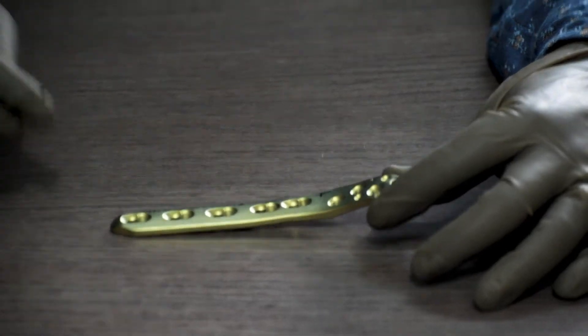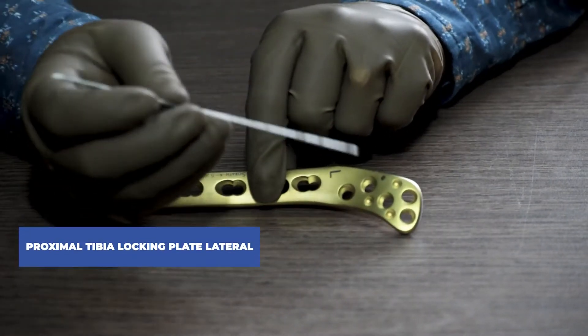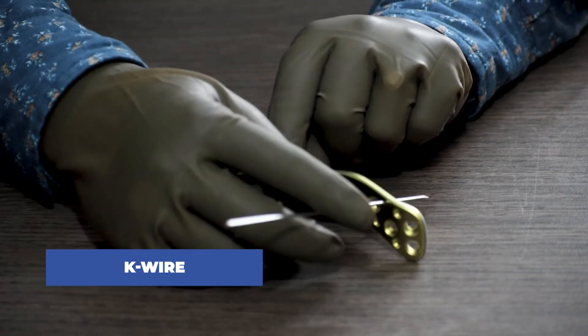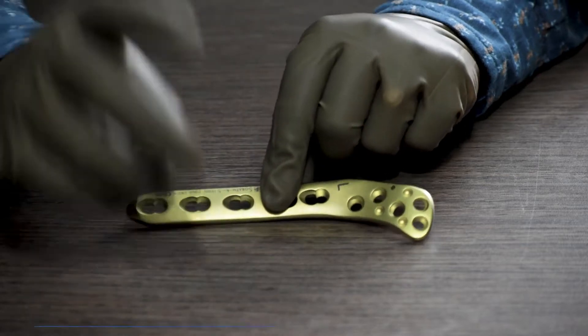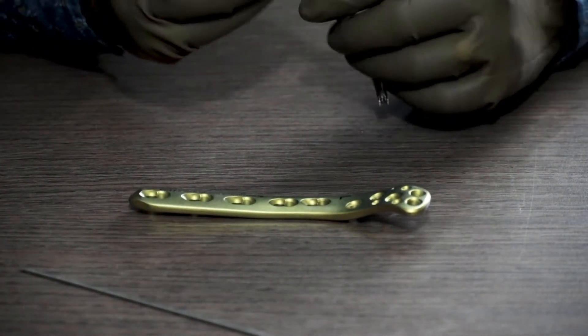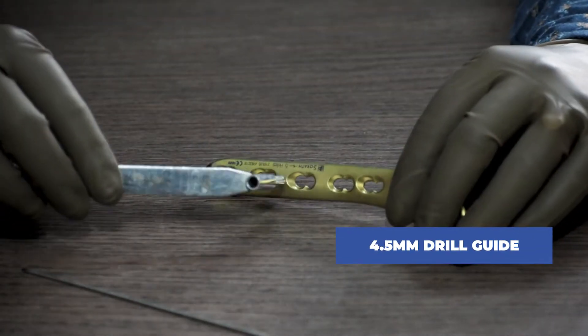We will start with the proximal tibia locking plate lateral 4.5 system. First, we will use a K-wire to hold the plate at the fracture site. The K-wire stays in, and then we will fix a non-locking screw in this plate. In order to do that, we will use a drill guide.